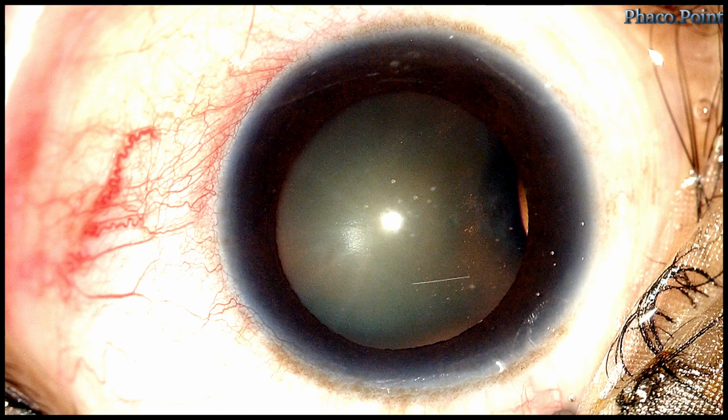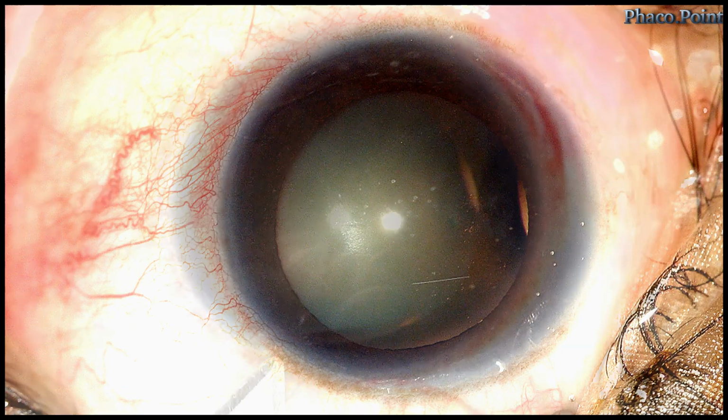The patient who presented to us clinically appeared to have a 2 o'clock hour zonular dialysis. There wasn't any obvious vitreous in the anterior chamber, and there wasn't any phacodonesis. Let's see what unfolds and let's see how we managed this case.